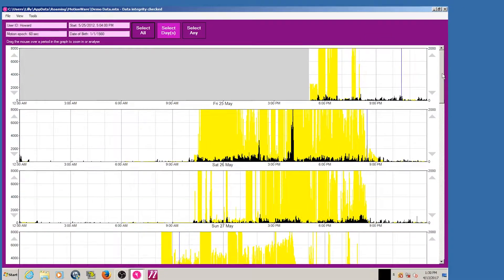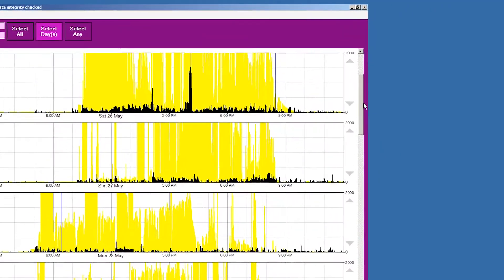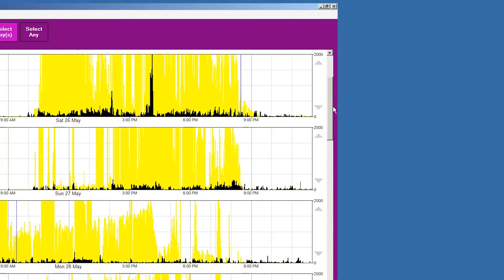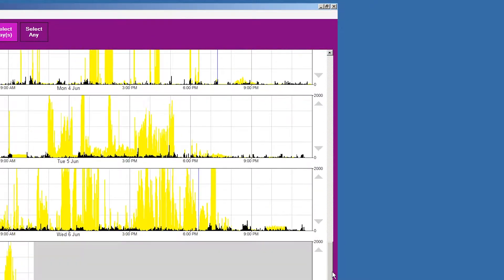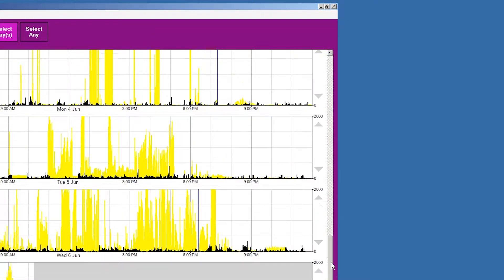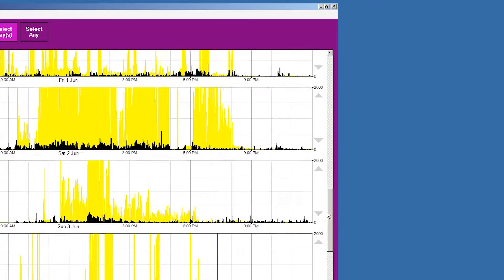You can scroll through the days by using the slider control at the right-hand side of the screen or by using the mouse scroll wheel.